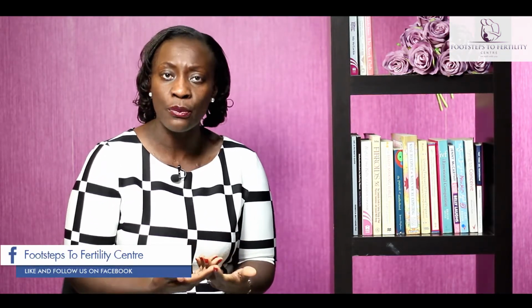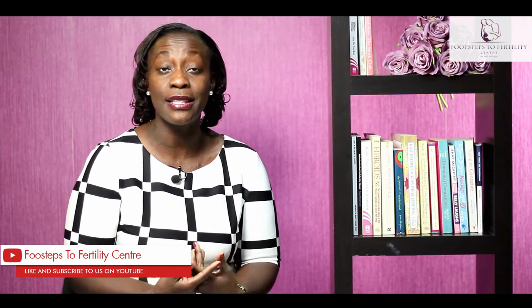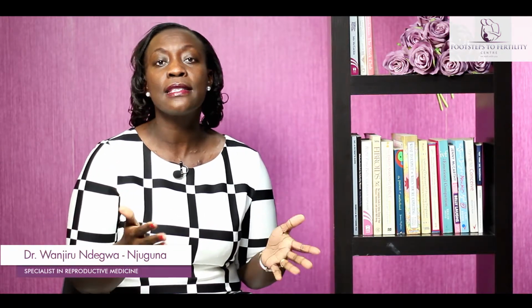So I think I've gone through the benefits of why we do it. It really does enhance fertility, and if you have any of the things that are obstructing implantation, they're removed. And some clients, all we do is remove those polyps, remove the fibroids, and 3 months later they're like, okay, I'm pregnant, and we didn't do really anything. So please never ignore simple things.